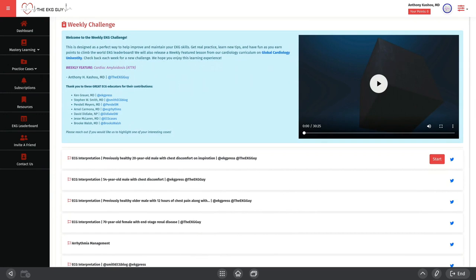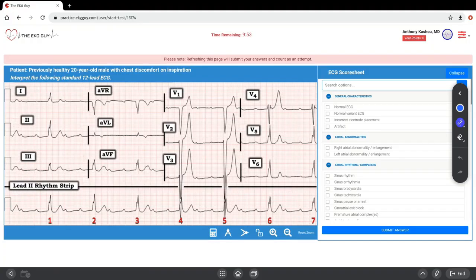Here are the cases, and we're going through this first one. The first one is submitted by a friend and colleague, Dr. Ken Grauer. It's the previously healthy 20-year-old male with chest discomfort on inspiration. We'll click that start button to look at this.